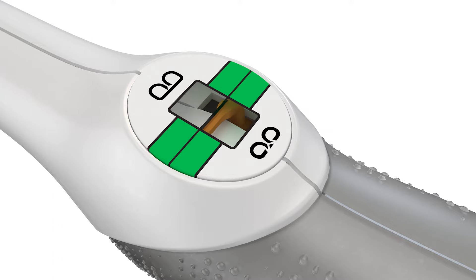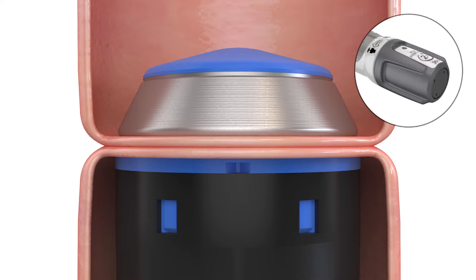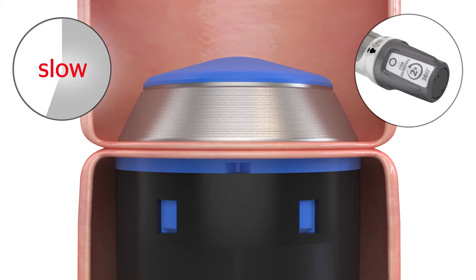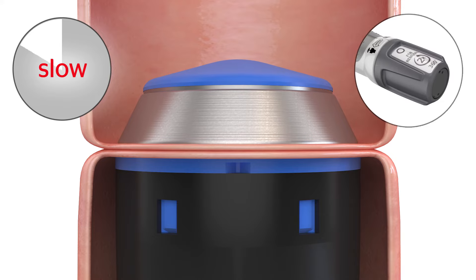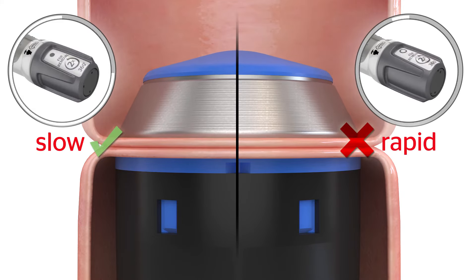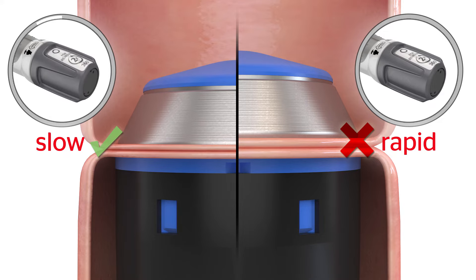Ethicon's circular staplers are designed to provide flexibility for use with different tissue thicknesses. As the tissue is being compressed, you will start to feel resistance in the adjusting knob. Continue to turn the adjusting knob slowly until appropriate tissue resistance is felt for a secure anastomosis. Rapid compression may not allow sufficient time for fluid egress from the tissue and generate resistance before the appropriate compression is achieved.